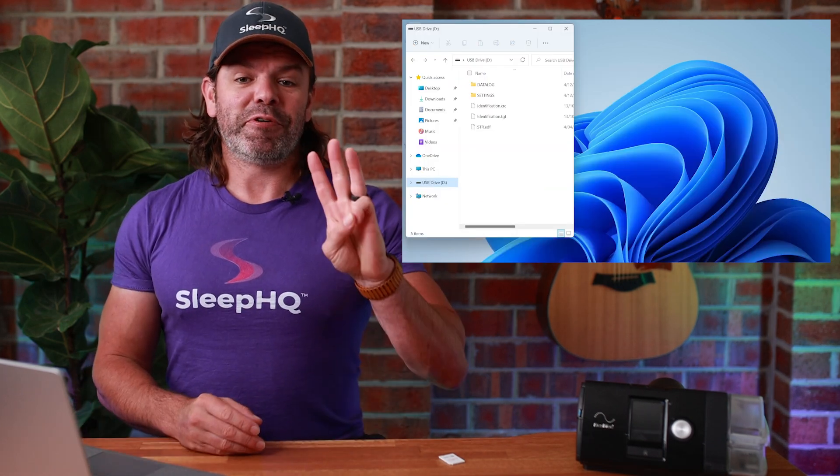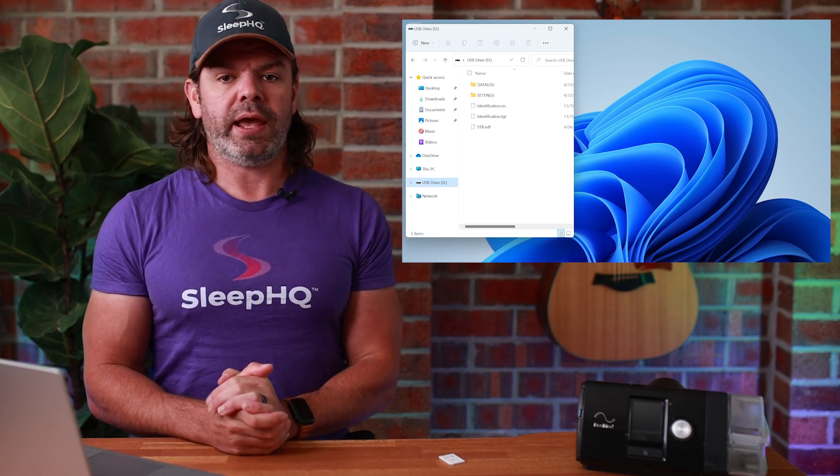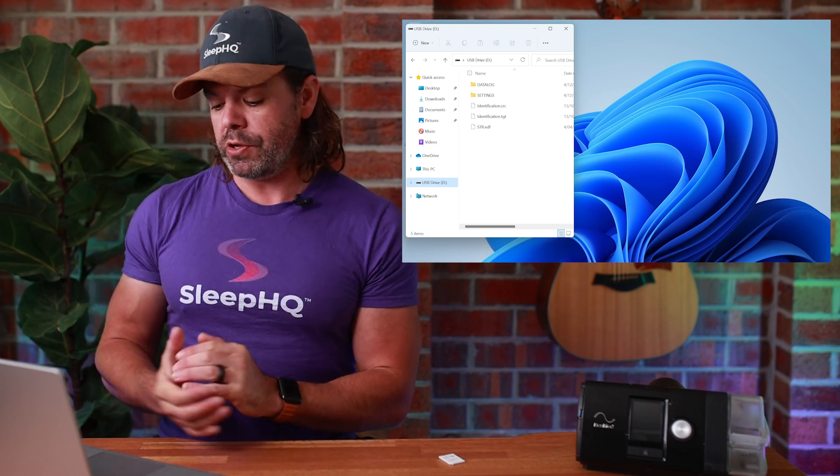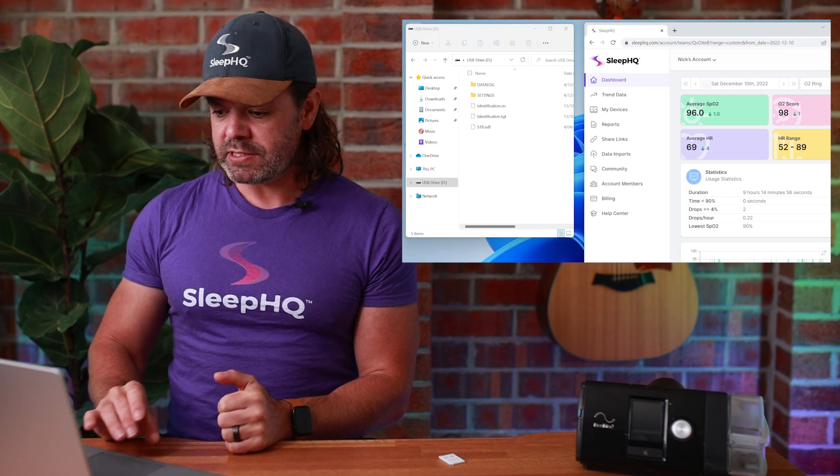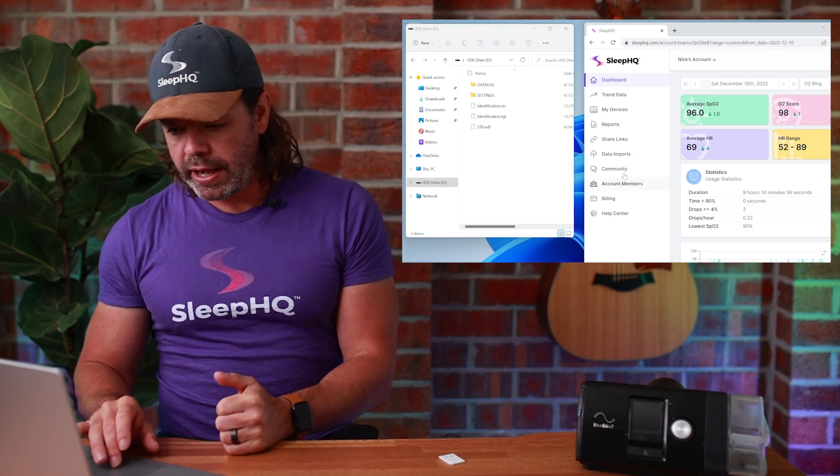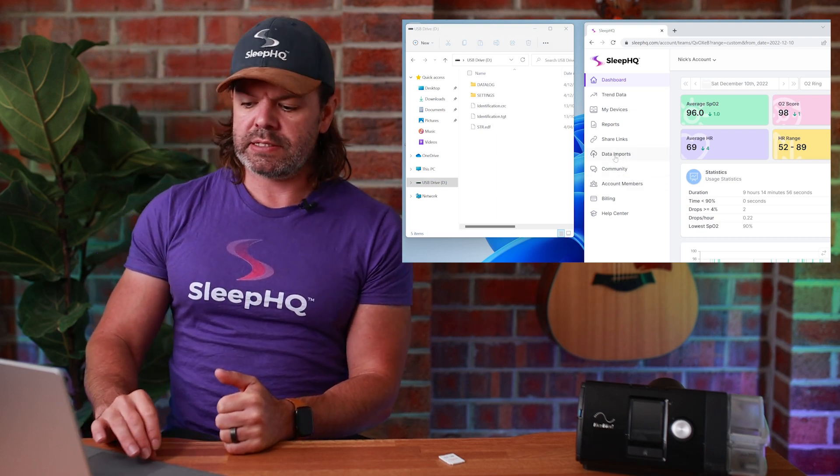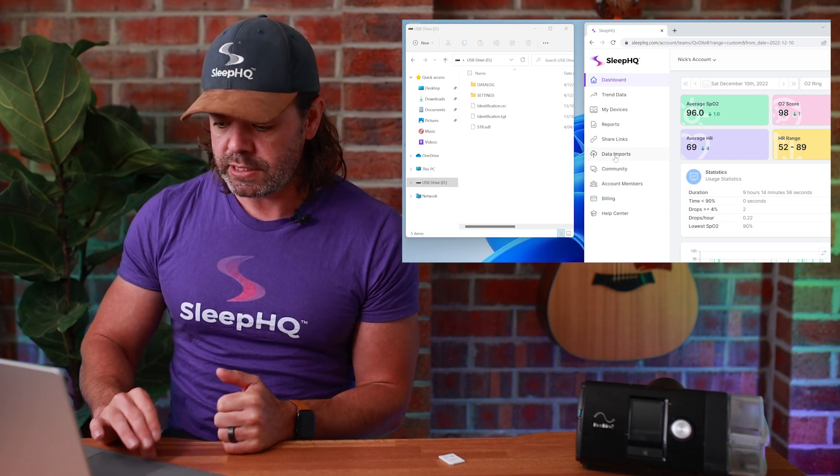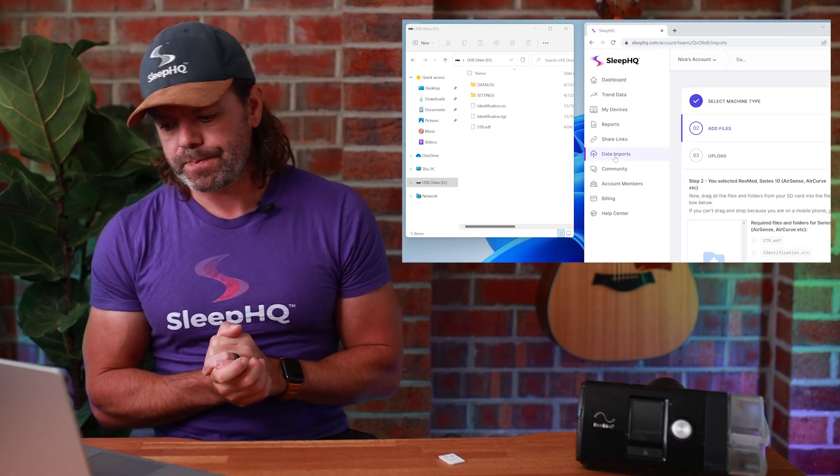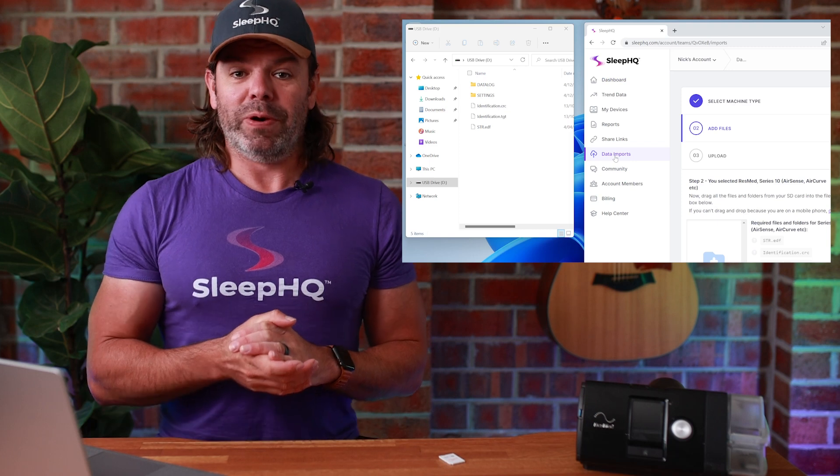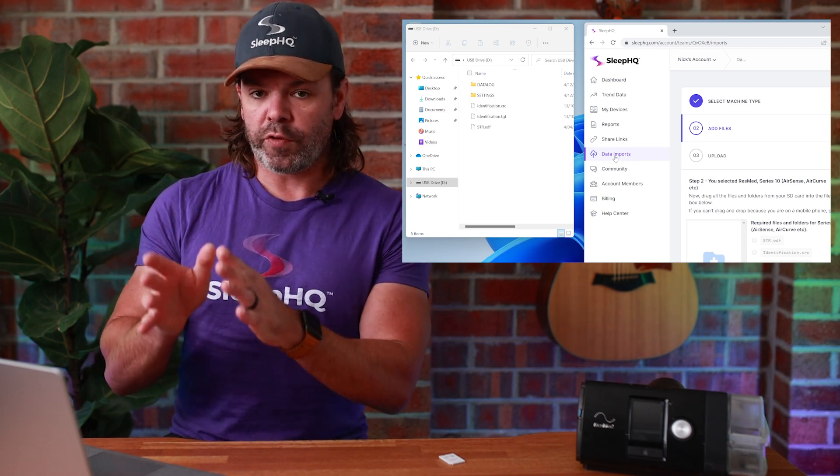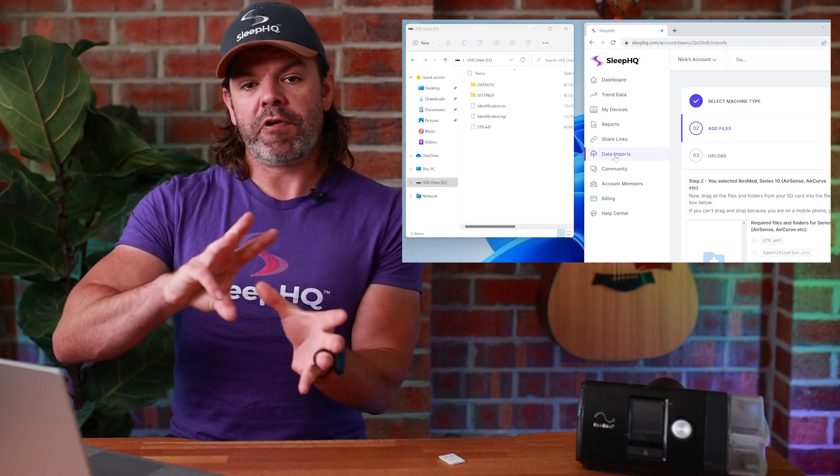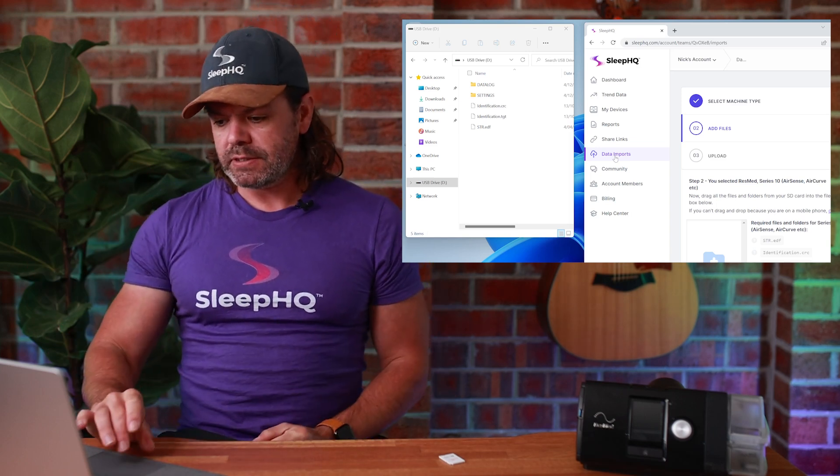Step three, we need to log into our Sleep HQ account and access the data imports menu. So here is my Sleep HQ account, and on the left hand side down here, you can see it says Data Imports. Click Data Imports, and now step four, we need to get the files from the SD card and drag them over into the Data Imports section. Let's do that now.